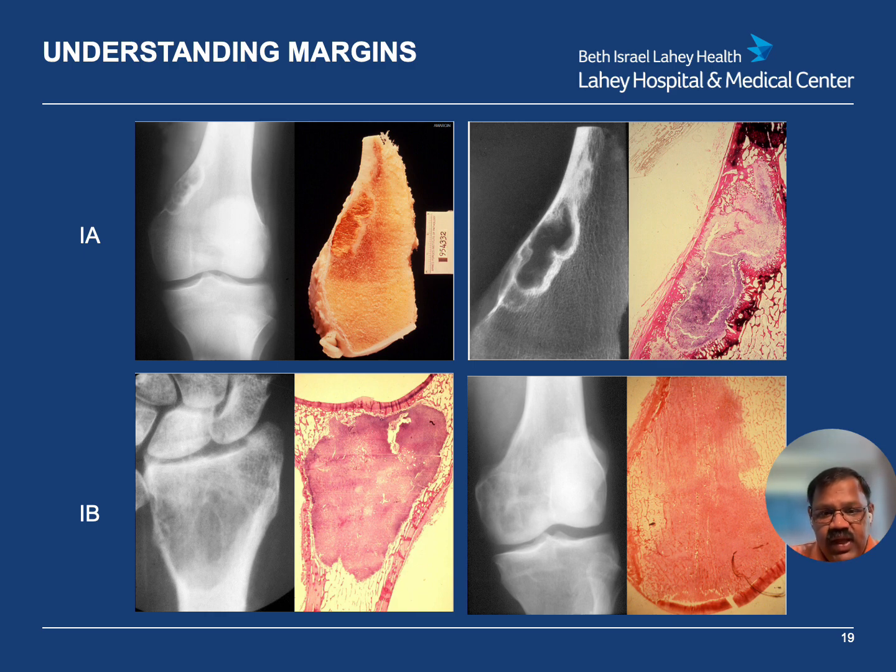On the right-hand side, again, you can see a zoomed-in view of that non-ossifying fibroma. Again, nice rind of a sclerotic margin. And on histopathology, you can see the lesional tissue right here, and then there's fine cortical bone all around it, very similar to what we see on the radiographs, and the lesion is completely separate from the rest of the trabecular patterning of bone.